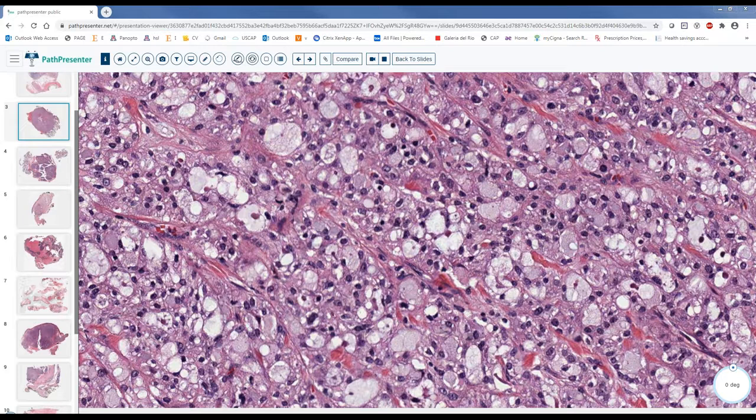So you will do your immunostains: DOG1, S100, mammaglobin, and I would love actually to do c-kit with that because I would like to see it for the differential diagnosis of adenoid cystic carcinoma, especially the cribriform. Again, most of these I deal with are needle biopsies, core biopsies. Rarely do I start with a resection; usually they will find it in an aspirated case first. All right, very good.